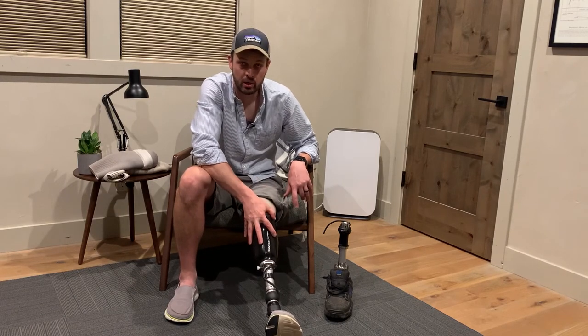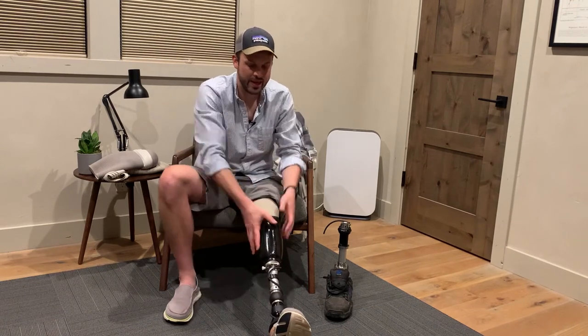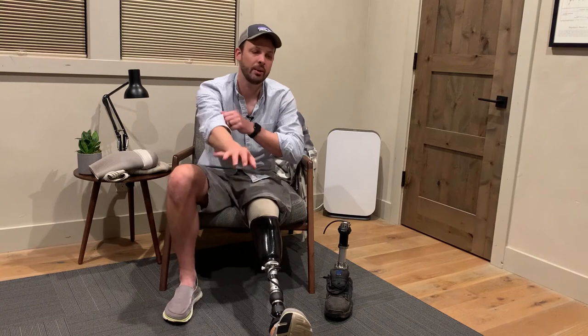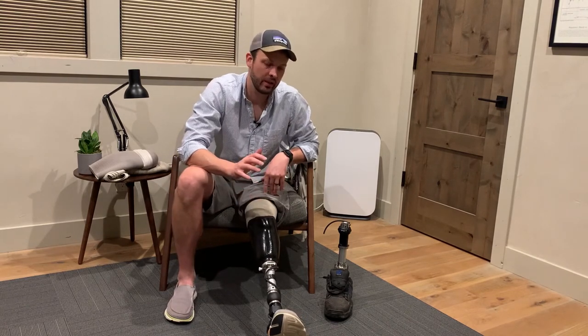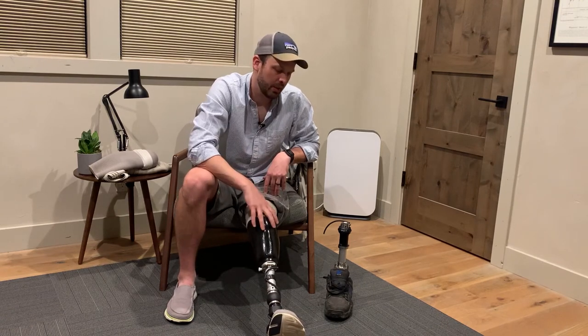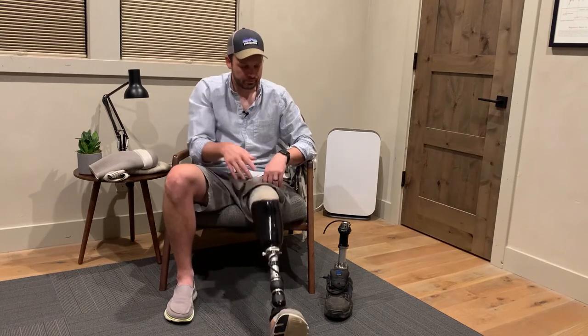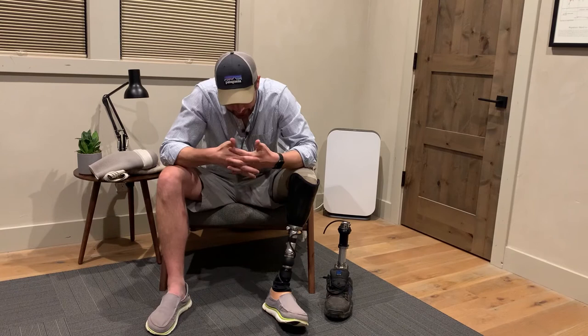That said, I really truly have never felt this secure in my socket, ever. When I add an extra sleeve over this, I feel like it's not going anywhere. It stinks to add the sleeve and the extra bulk and weight, but knowing your leg is going to stay on and not shift at all is amazing. Anyways, that's a quick overview of both the pin and vacuum system — I like it, I've been really happy with it.